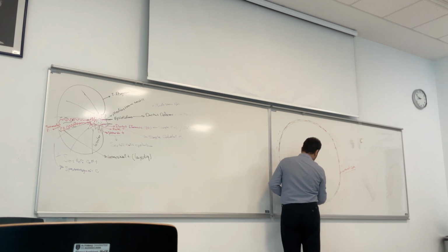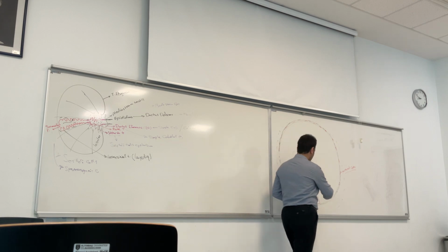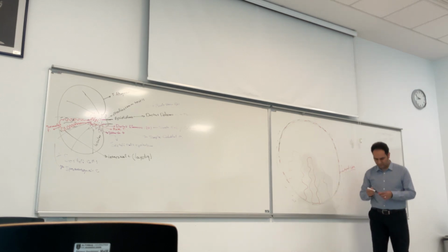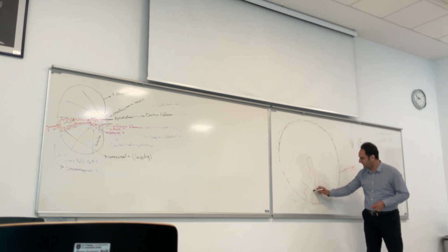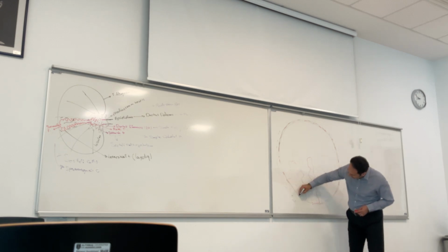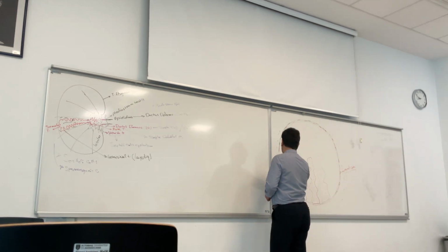These cells, and also another cell here. You can see, these are our main protective cells present in the wall of the seminiferous tubule. What is the name of these cells? Sertoli cells.